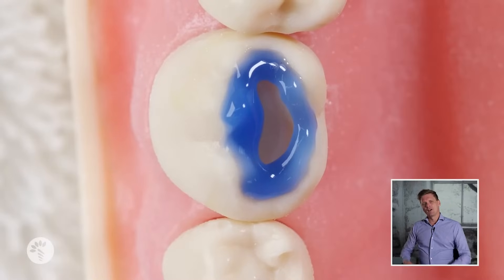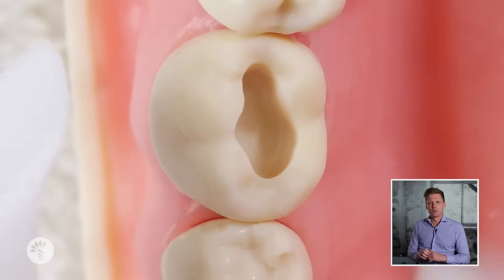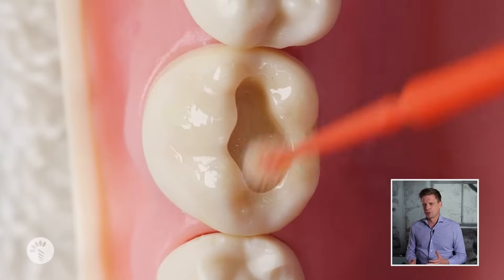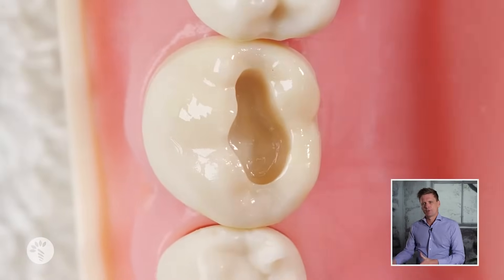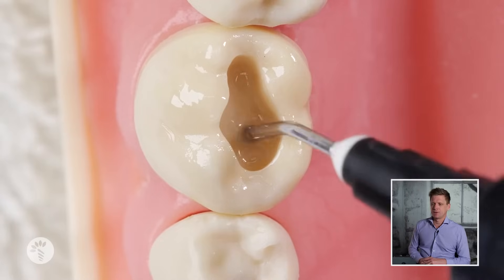You can etch enamel but you can't etch plaque and you can't etch debris, and there's a huge amount of it. If you want to see how much is on a tooth, get a bit of plaque indicator dye, paint it on top of the tooth, and see how much pink there is. After air abrasion we etch just the enamel, because I'm using a self-etching bonding agent called Essie Bond 2 — it has a primer and a bond. We want to thin both of those so we don't have a thick layer of cement showing on the x-ray.